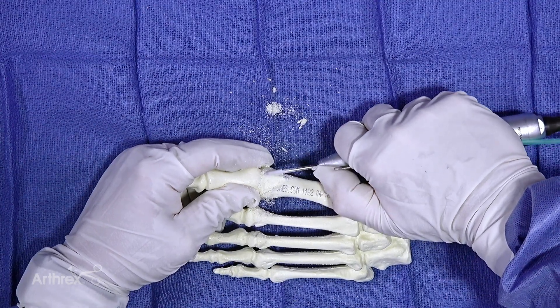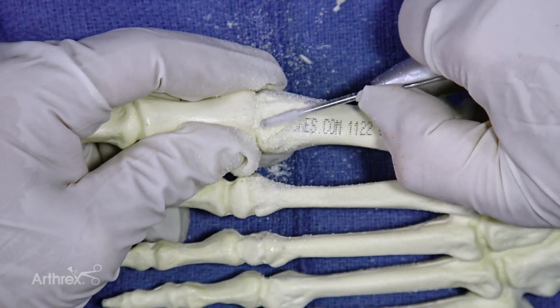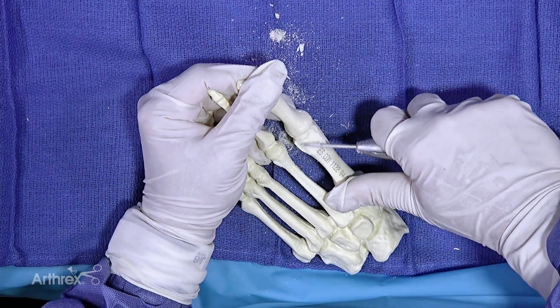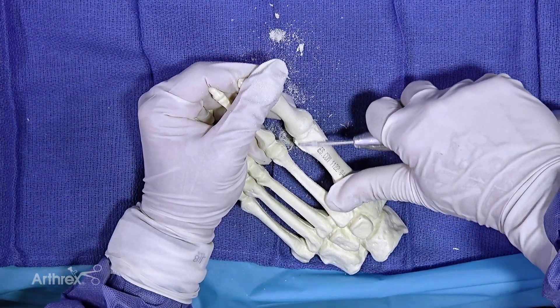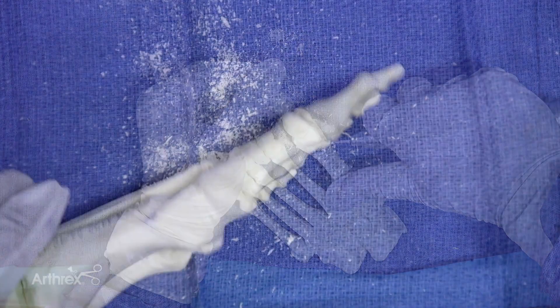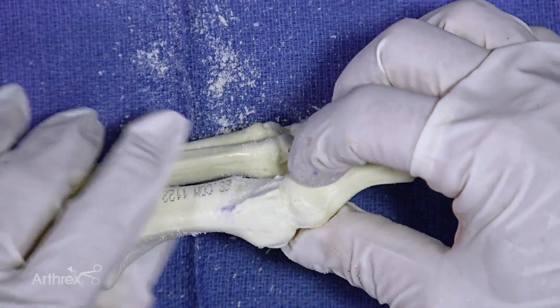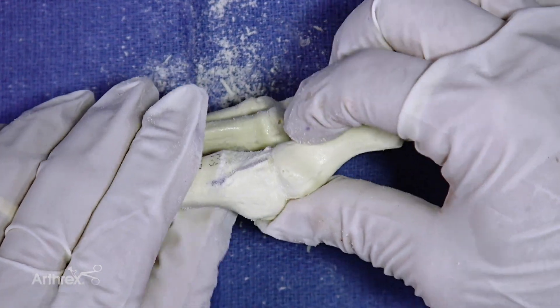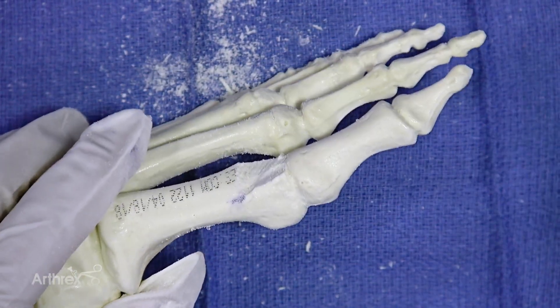Smoother cut. And obviously always keeping in mind your incision when you're doing this. If you have a spur in the proximal phalanx, you can also take care of that in the same fashion.